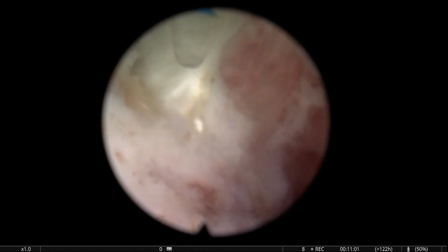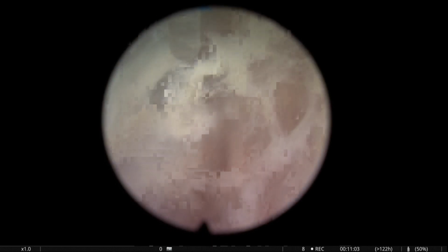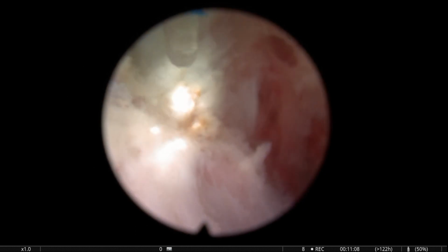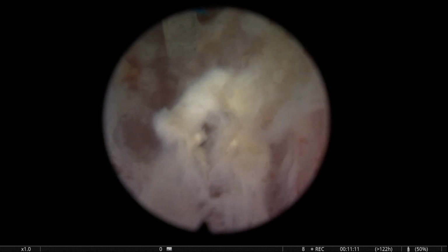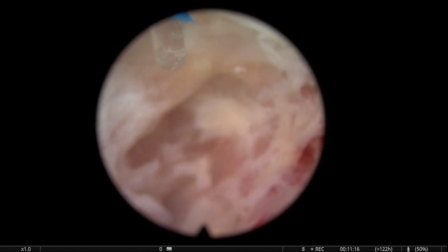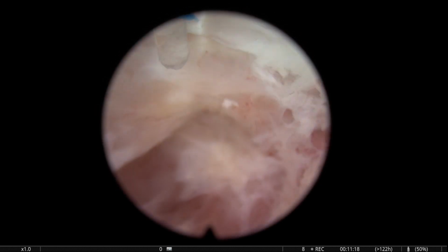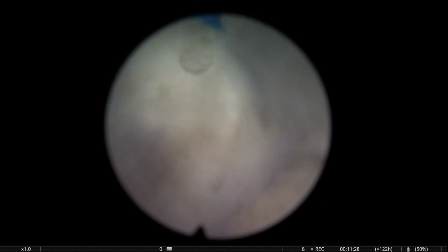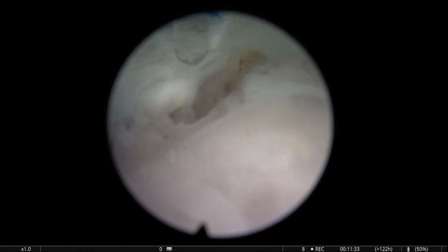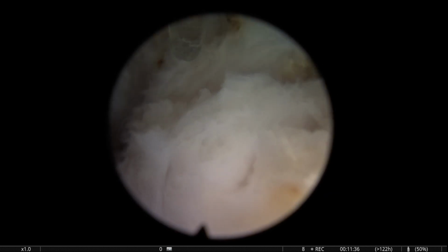It's sometimes tricky, and we have to try to, you see, connect the lines and try to see what plane is more convincing. If you are investigating a plane that is going a little bit deep and you find, you know, that you're coming out of the capsule, then of course we have to correct. But using the energy with a soft effect, you see that I don't try to be excessively aggressive dissecting the plane. I want to do several passes, and each pass is doing a little bit, so that allows us to understand a little bit better how things work.